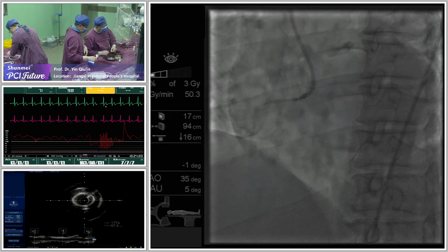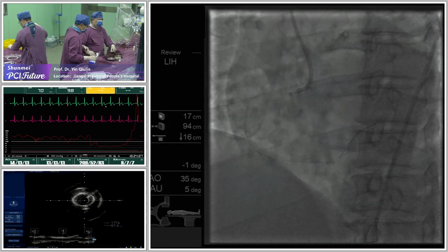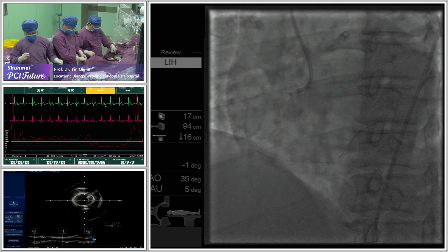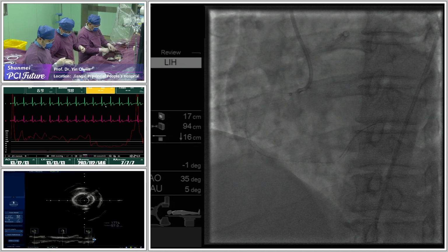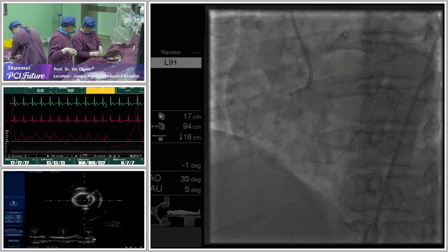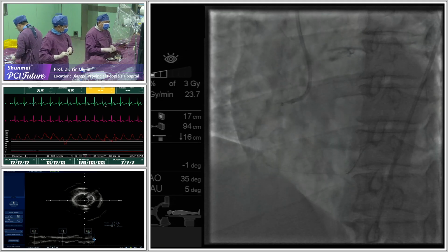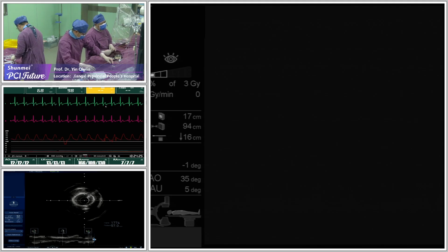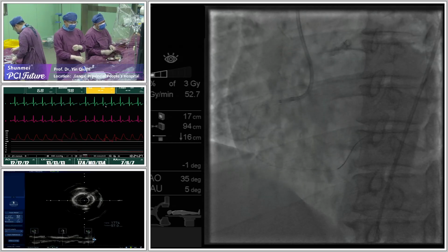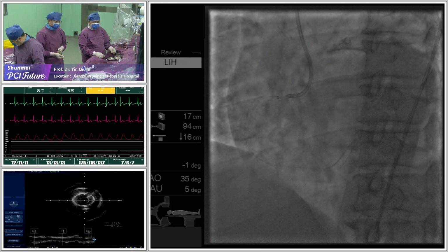Yeah. 这个是3.0的，它指甲没坏。The segment of hematoma is about 10 to 50 millimeters.